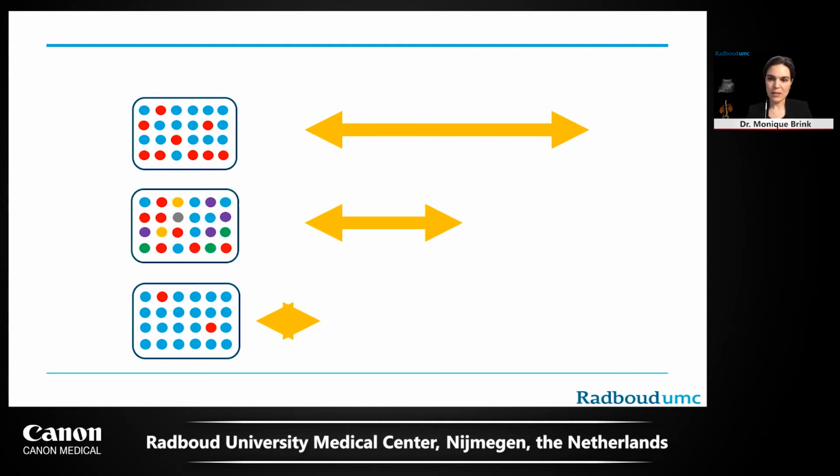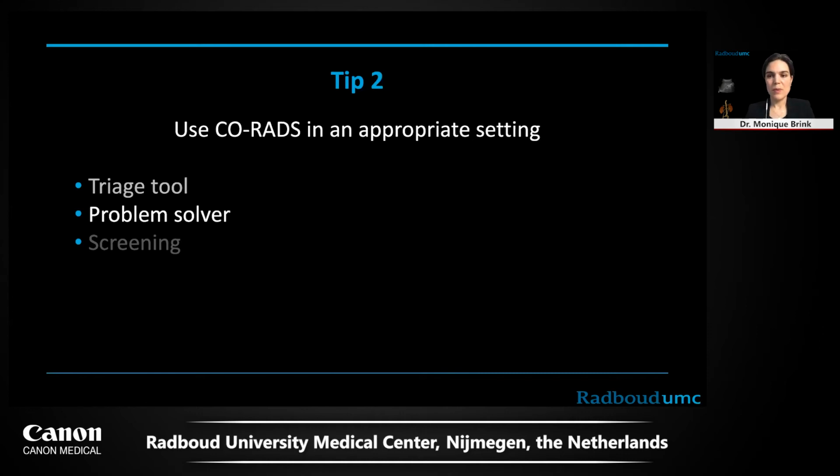And you can imagine that CT will perform less well as you're left with the most complex patients, but it might be that CT might still discriminate a little bit between different alternative diagnoses. So that's my top tip 2. Use CT and especially CO-RADS in an appropriate situation. Don't use it in a screening, or don't use it in asymptomatic patients, even if you're asked to do that, for instance, on an oncological scan in which you find bilateral ground glass.